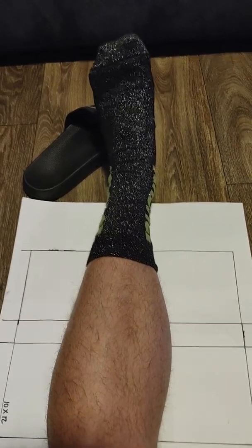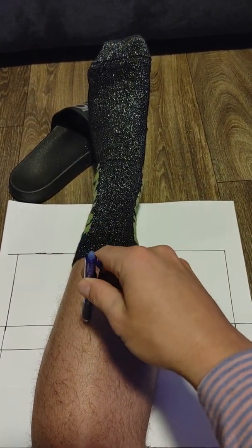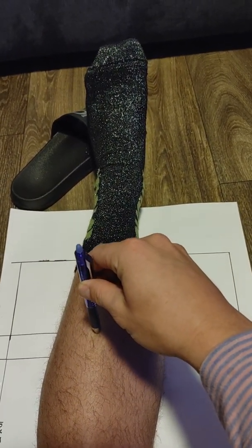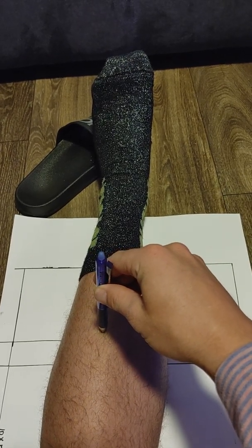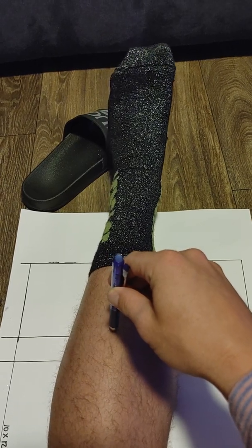So first we're going to have the patient place their leg like so. Central ray is going to be directed perpendicular to the shaft of the tibia. And we're going to try to collimate the ankle joint and the knee joint if possible.